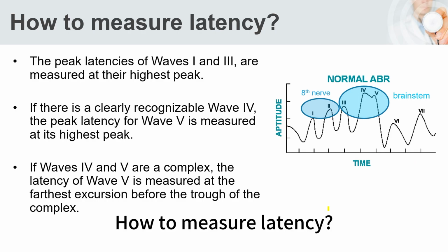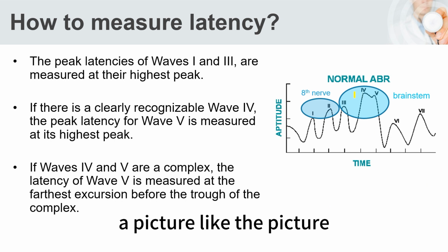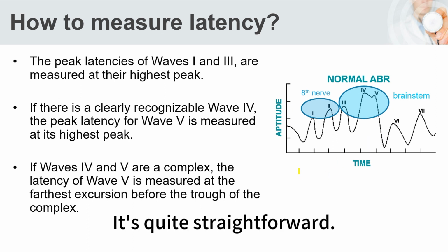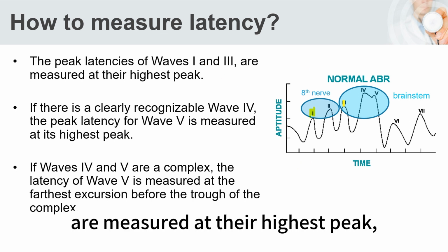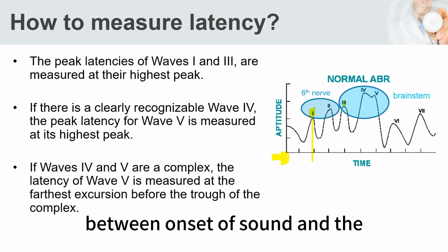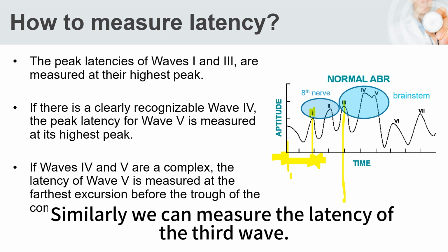Then how to measure latency, right? If we see a picture, like the picture on the right, how do we measure latency? It's quite straightforward. The peak latency of wave 1 and 3 are measured at their highest peak. Which means for wave 1, that's the duration between onset of sound and the point of the peak of the first wave. Similarly, we can measure the latency of the third wave.